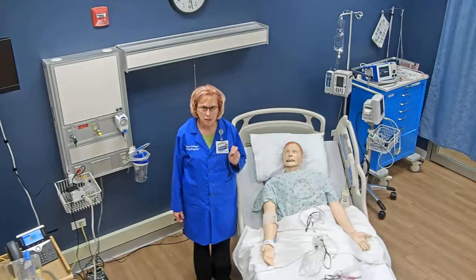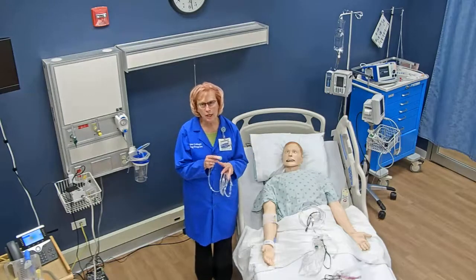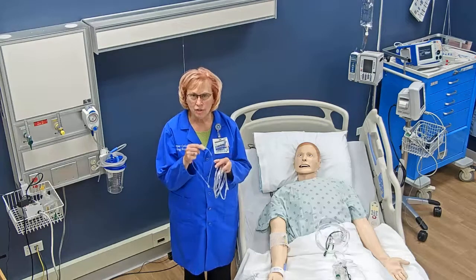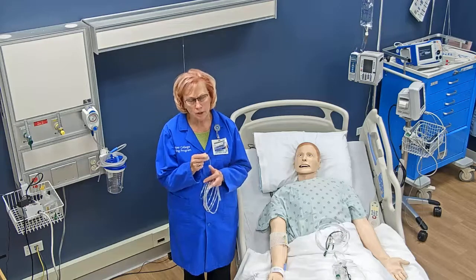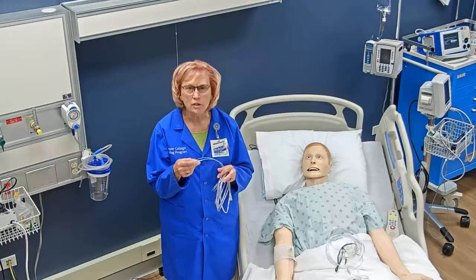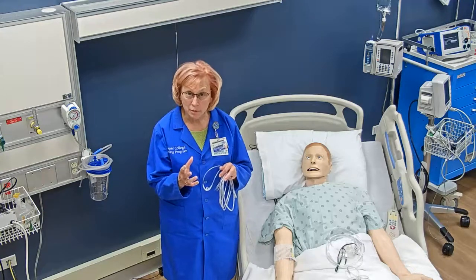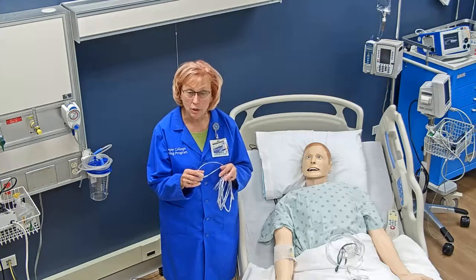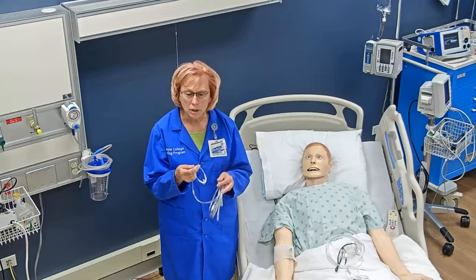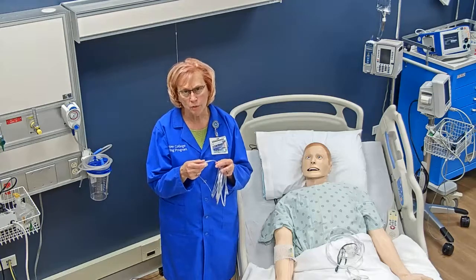I'm going to start with the nasal cannula. This is your first-line therapy for a patient who is stable and whose oxygen saturation is a little bit low, but not terribly low. For example, if your patient's oxygen saturation is 88% — normal is 98% or above, and acceptable is 92% or above — so 88% is low but not terribly low, so we would start with a nasal cannula. A regular nasal cannula can administer from 24% to 44% oxygen.